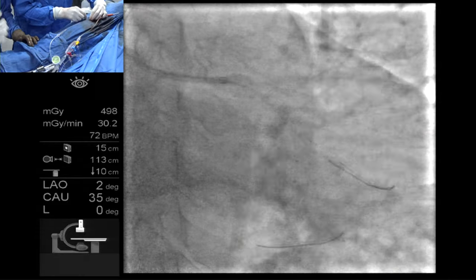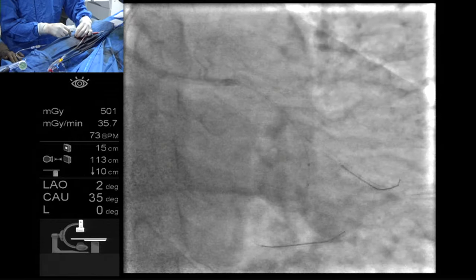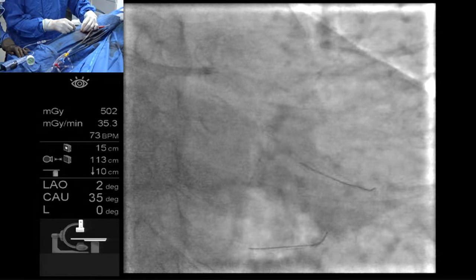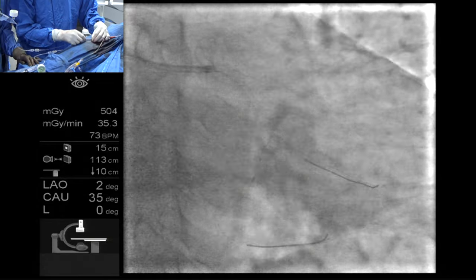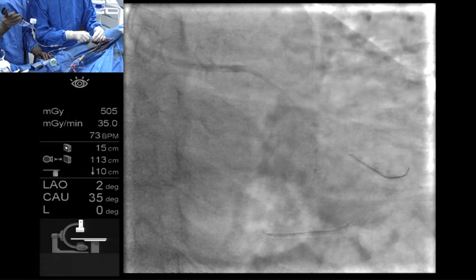You know, the stent seems like it's not there at the ostium. Really? No, I don't know. The visibility is not great. I know it is. I think it's there. Your eye is better than mine, but I cannot be 100% sure.